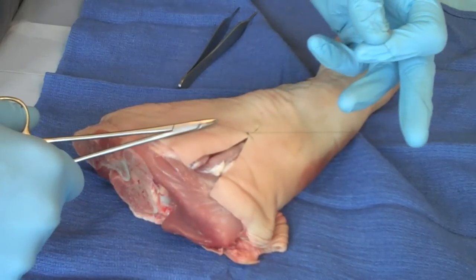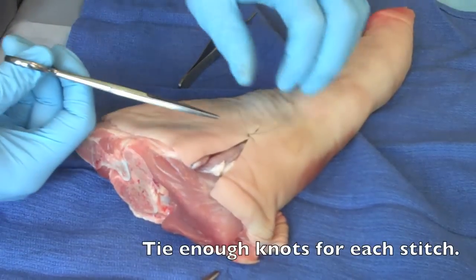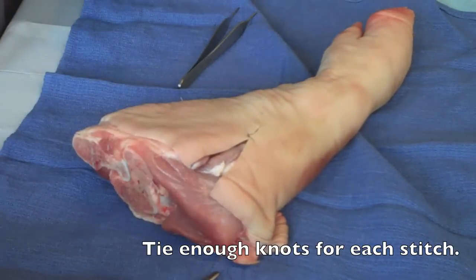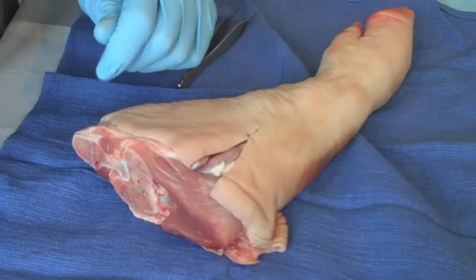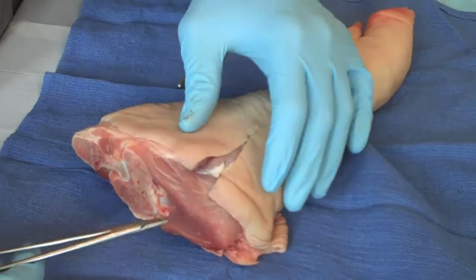Many people ask how many knots do I throw for each suture? My sense is you want to throw enough — enough to keep it tight and snug without doing too many or too few. If you do too few, it will become untied. It's the one thing that patients will notice. So make sure that you throw a good clean knot and do a careful job with that.